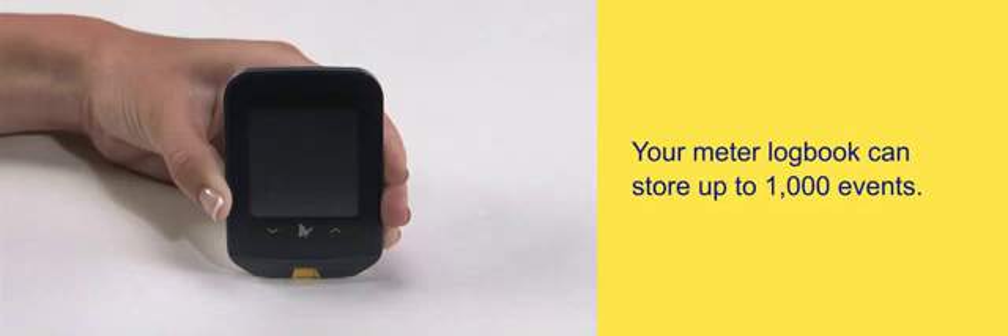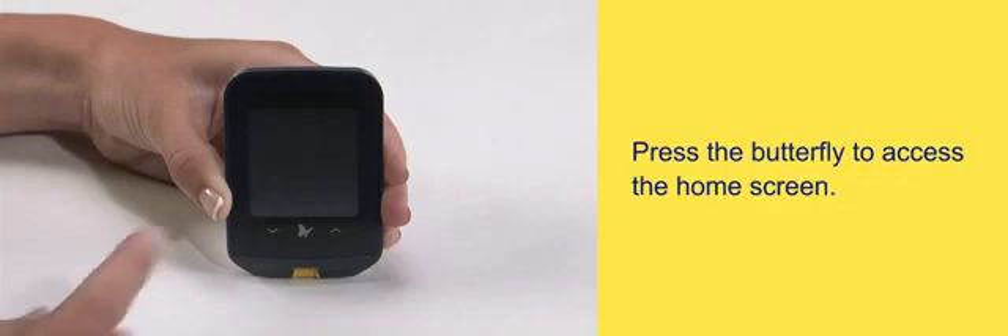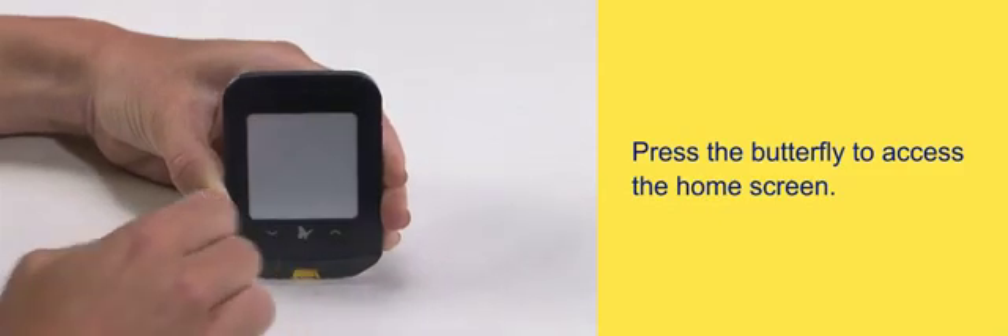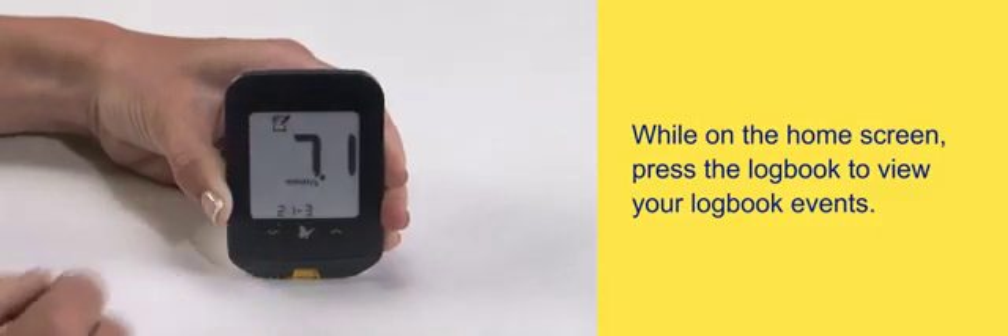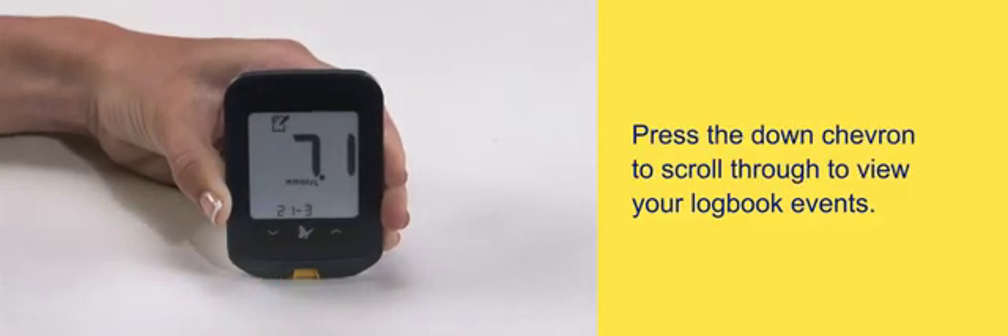Your meter logbook can store up to 1,000 events. Press the butterfly to access the home screen. While on the home screen, press the logbook to view your logbook events. Press the down chevron to scroll through and view your logbook events.